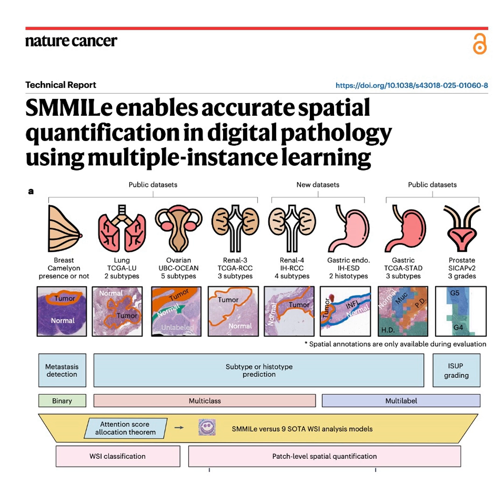Yeah, MRF sounds intimidating, but it's essentially a mathematical way to understand spatial relationships. SMMILe calculates two things here: unary energy and pairwise energy. Unary energy is the AI looking at a single patch and asking, based on my training, does this specific patch look like cancer? But then it uses pairwise energy, which I like to call the peer pressure mechanic.